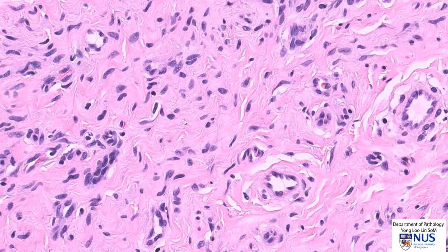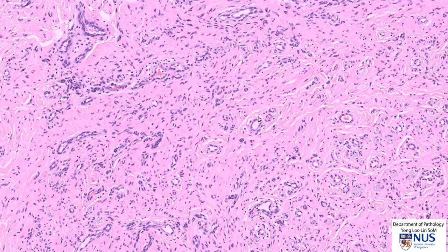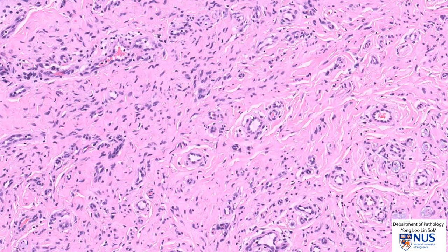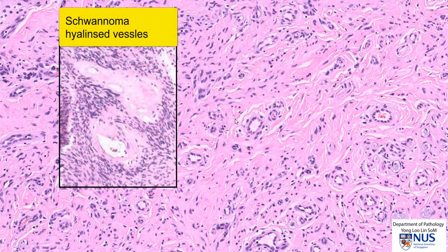In between the nuclei, we can see these pink collagen fibrils. So we have spindle cells and we have collagen. We also have some blood vessels, and these vessels are different from those seen in schwannoma. Often in schwannoma, the other benign peripheral nerve sheath tumor, the blood vessels have thickened, hyalinized, pinkish walls. These are just regular blood vessels.